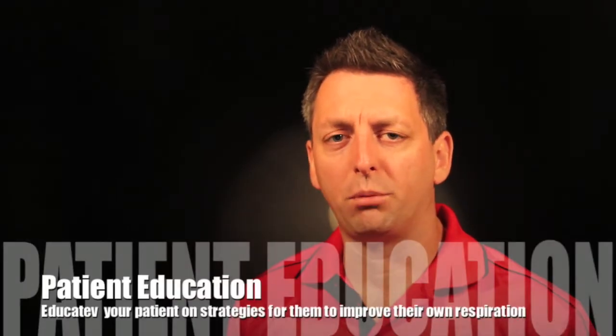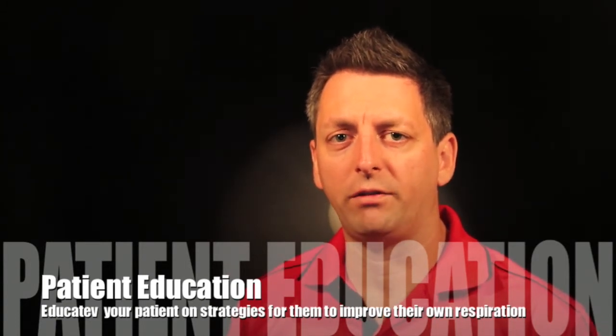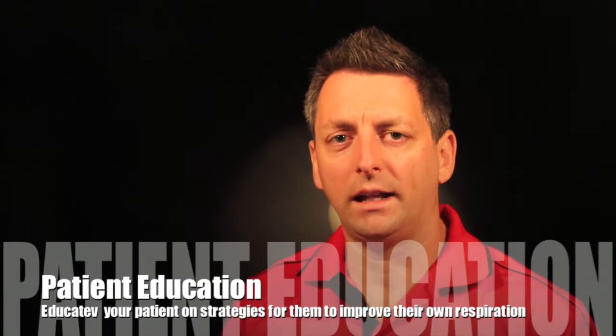You have to be assessing the patient, seeing if you do take their mask off, are they deteriorating because I'm trying to do this stuff? So these are the things you need to weigh up when you're doing it. But usually it will help increase the compliance of non-invasive ventilation. Once you've started getting the patient used to being on the ventilator, get them thinking about their breathing and trying to control their breaths as well, because they can have a bit of input, gives them a bit of control back and helps them to work with the machine and get better results.